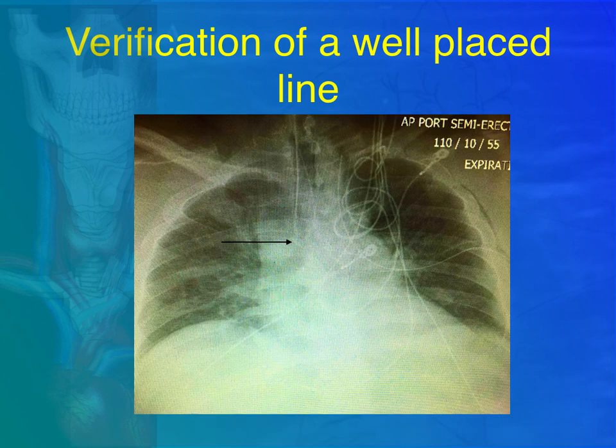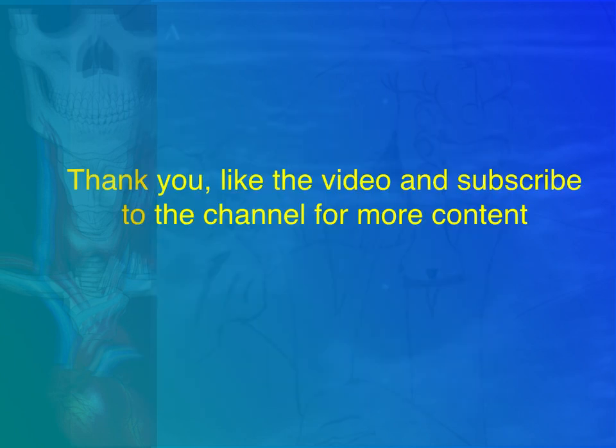Here, a well inserted line about 1 centimeter above the carina or around the carina, and this is an IJ.